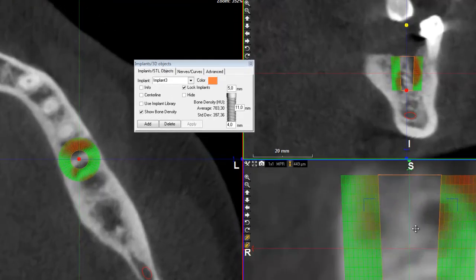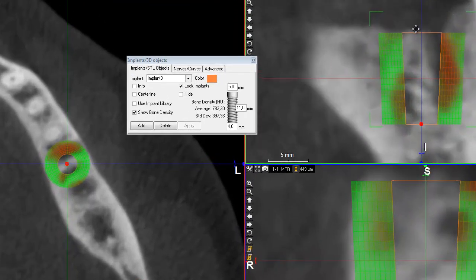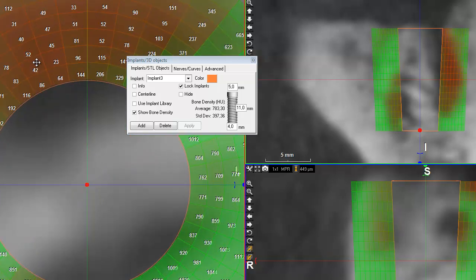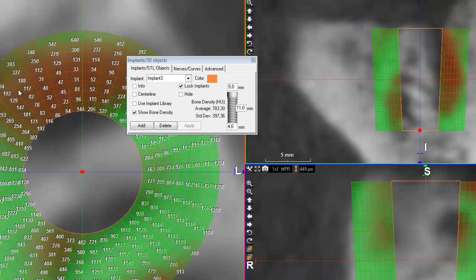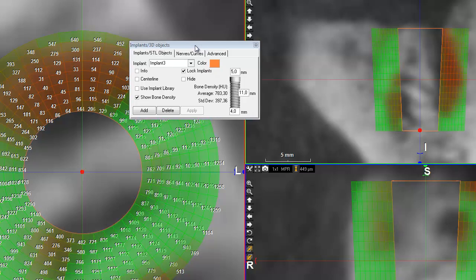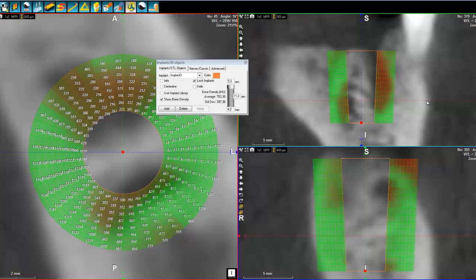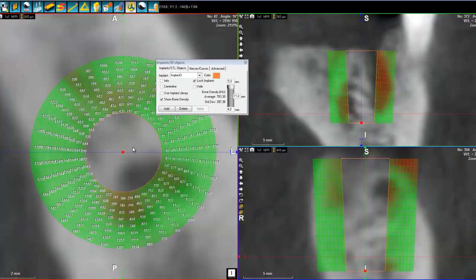I can zoom in on it, and look at what happens when I zoom enough — I can see the Hounsfield unit values around my implant. The red line is here, and as I move the mouse, the red line goes down, so I can read any single Hounsfield value within the bone density.